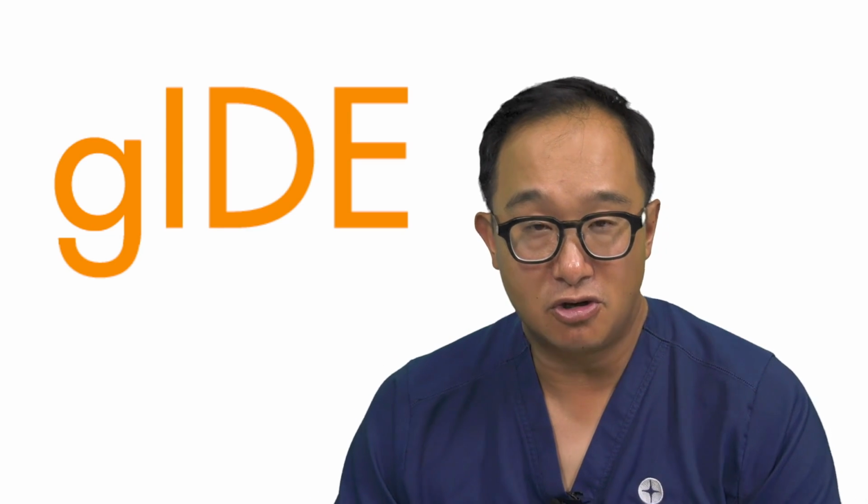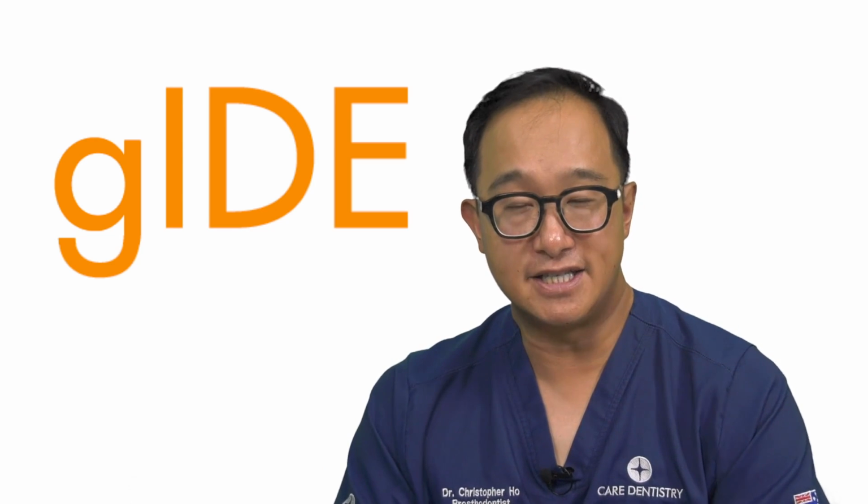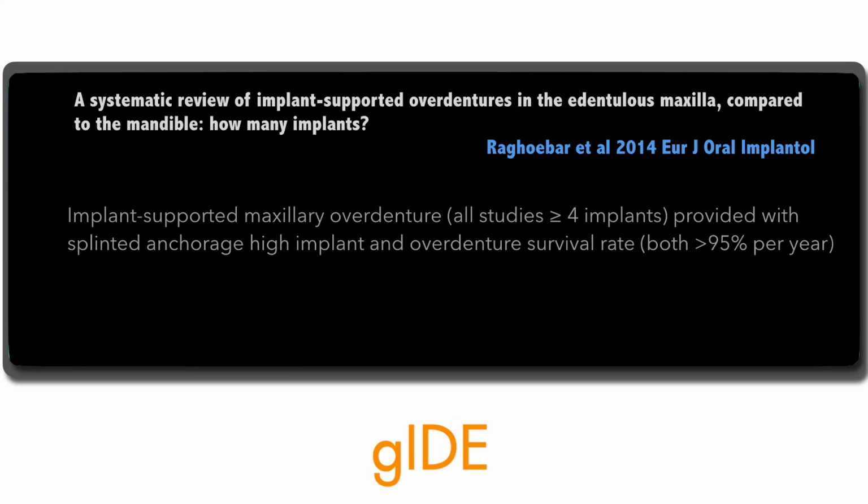Now I wanted to talk a little bit more about the maxillary overdentures. So Ragabar in 2014 did a systematic review, and they looked at the numbers of implants required, and the numbers of implants need to be 4 or more, and they need to be splinted together. And they had a success rate of greater than 95% when they did that.